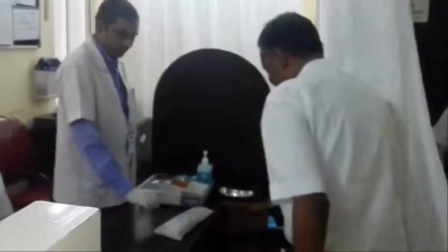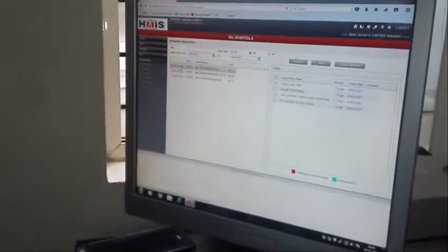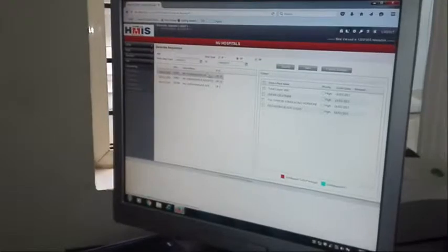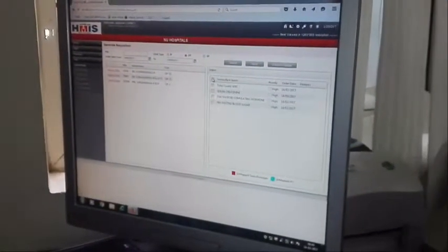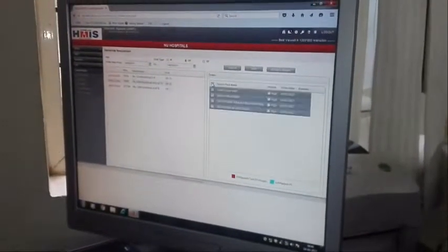The staff asks the patient to be seated and takes measures so that the patient is comfortable. The next process is generating the barcode. The barcode is generated by entering the patient's necessary details into the computer and clicking on the required options. Each barcode generated is specific to a particular patient.